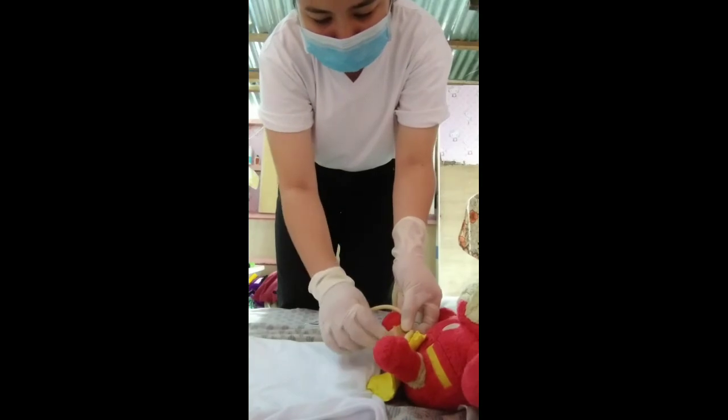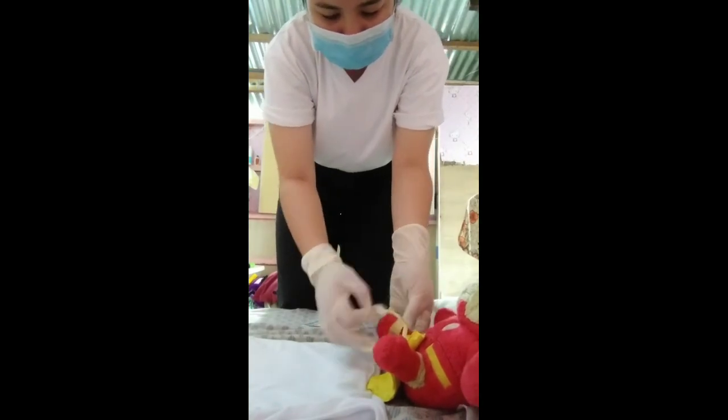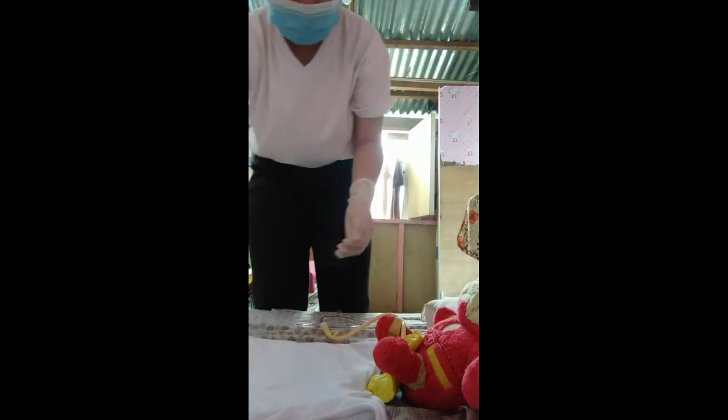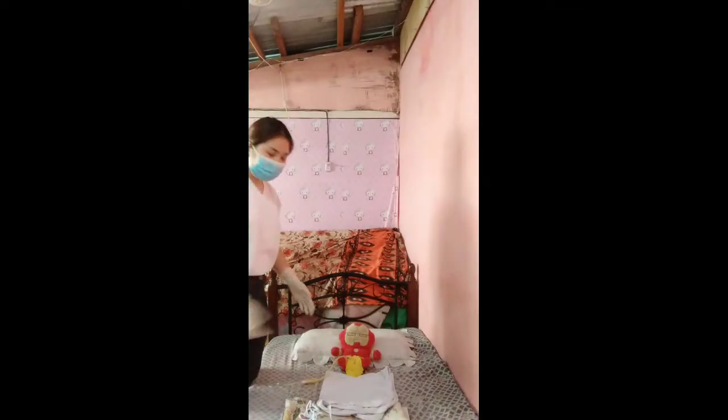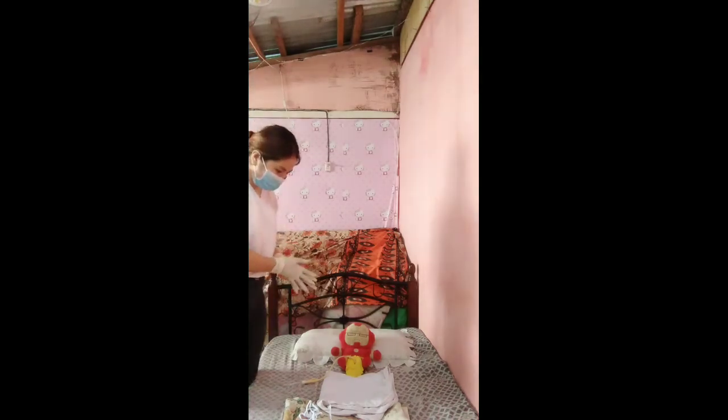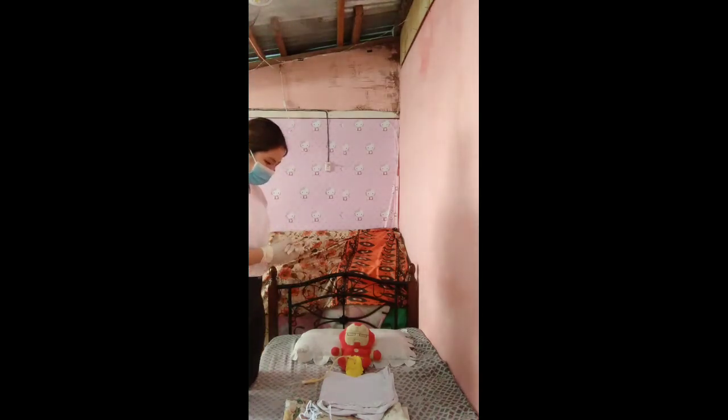This is a tape. So that's all. So after putting the catheter into the urethra of the patient, it's perfect, ma'am.